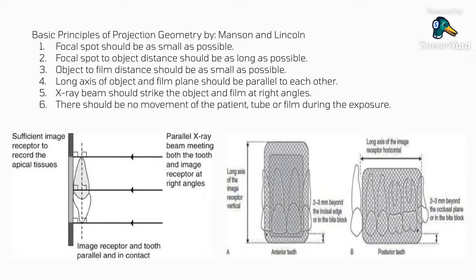Okay. All right. Now, I am talking about something that is very idealistic, but we know that practical is not exactly ideal. So, you see, the anatomy of oral cavity does not always allow us to use these ideal positioning requirements, okay, to be satisfied. So, in order to overcome these problems, we have two techniques that have been developed in the periapical. It is the bisecting angle technique and paralleling technique. We are going to discuss these, okay? But there are more techniques that I will touch upon, okay? All right, next slide.